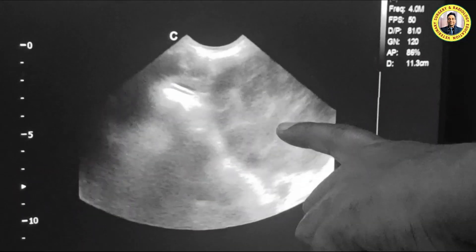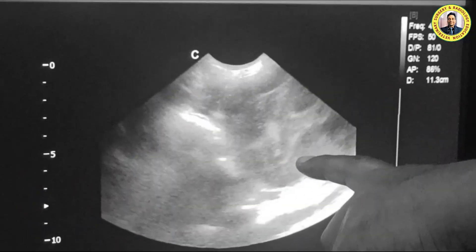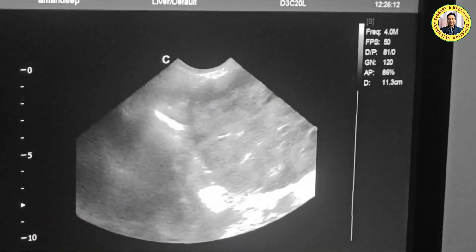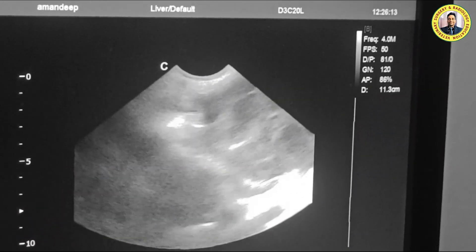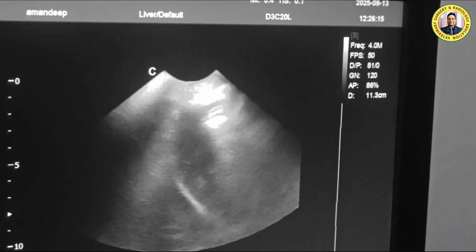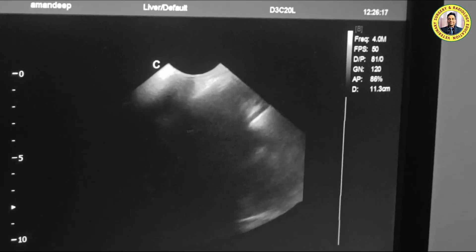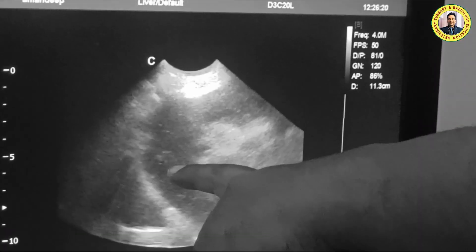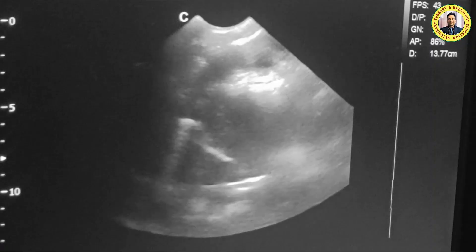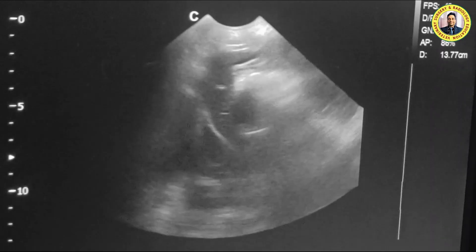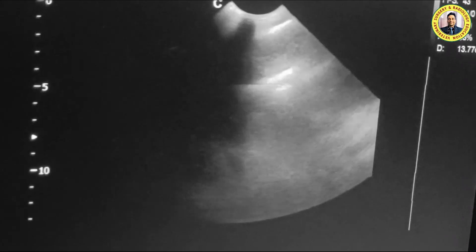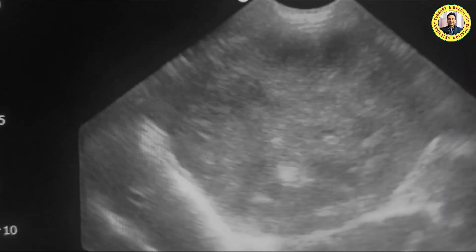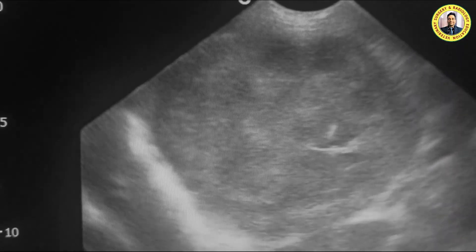If you see here, there is soft tissue echogenicity. This is the left lateral lobe of the liver — the left lateral lobe of the liver is visible now. You can also see this hard mass.